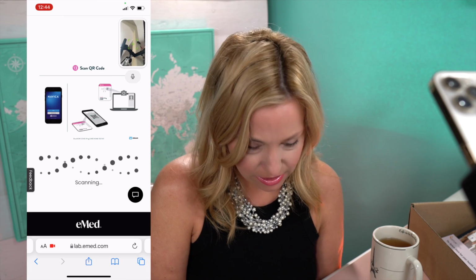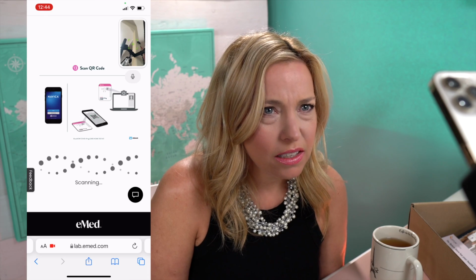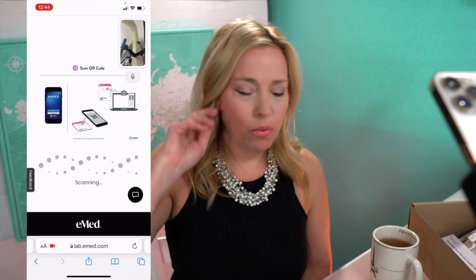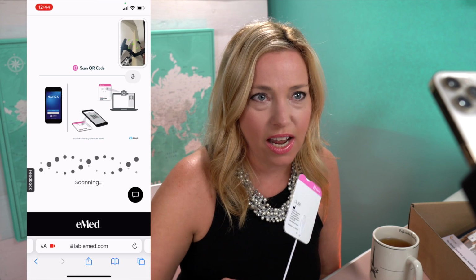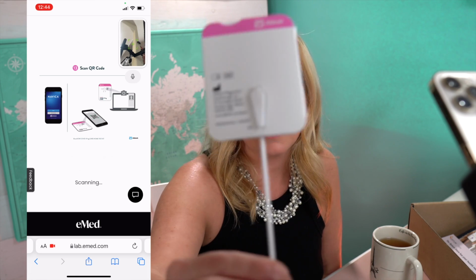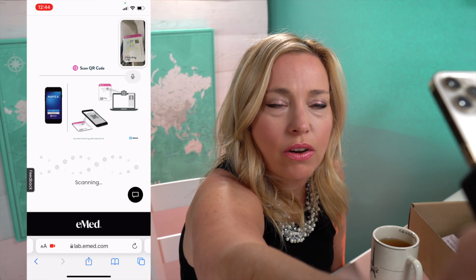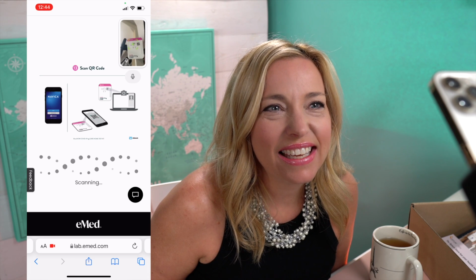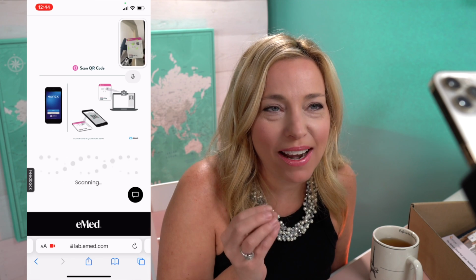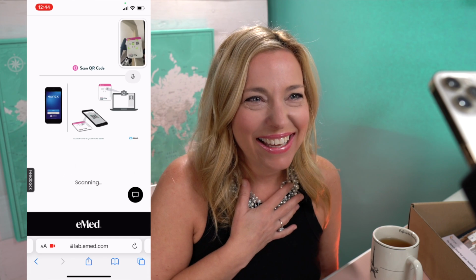Now, Cherry, please hold the test card in front of your device camera so I can scan the QR code and see the result. Hold it in front of the camera, so I need to place it on the other side now. Yes, that's correct. Okay, I'm bringing it around the other side, just like this? Yes, that's perfect. Leave it there for a moment. Hold it so it's more steady. Perfect. That was weird. The camera flipped around, and I didn't expect that. I'm sorry, the system does that.